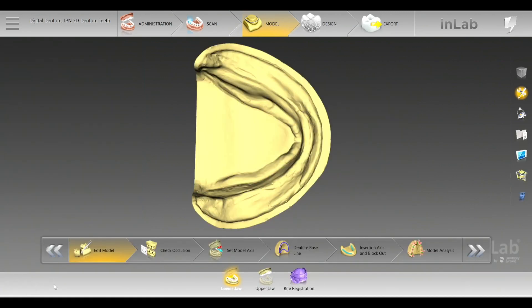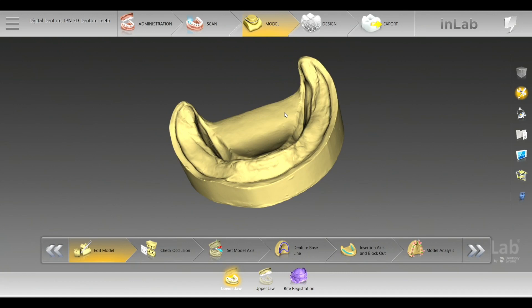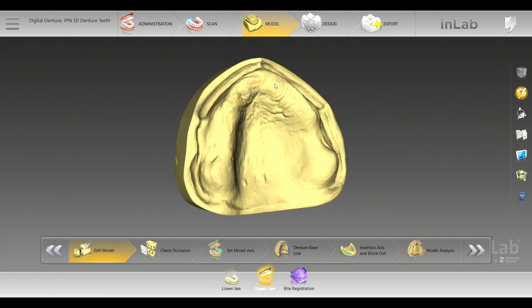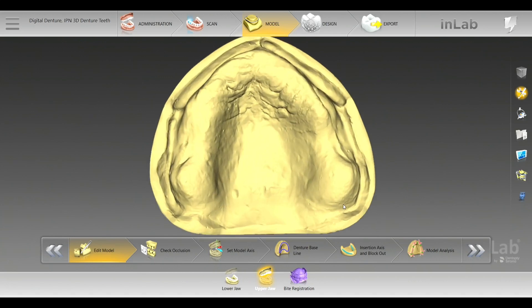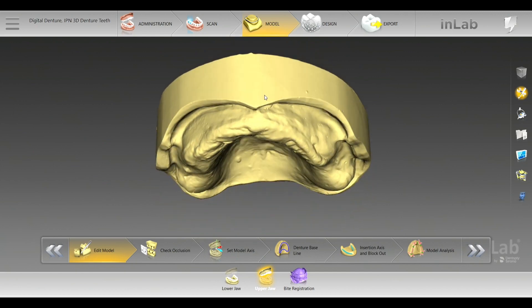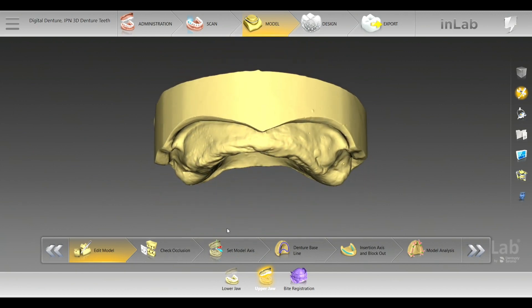Moving on into the model phase, you'll have the edit model, which is great. If you see any blurbs or imperfections at this stage, you're able to edit them and smooth them out — any wrinkled areas on the upper jaw. I want to make a good note: you want to scribe in your post dam in your model before scanning. Currently the software does not have the ability to create a digital post dam. If you scribe your post dam in and then scan it, you'll have a 3D representation. The way digital is nowadays, the fits we're getting from milled or printed is remarkable.